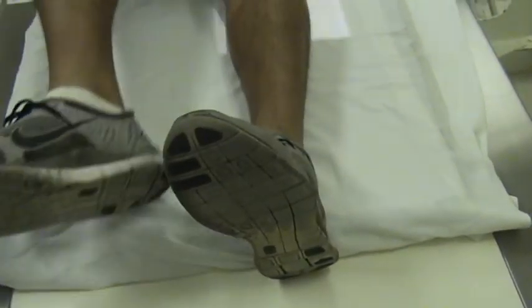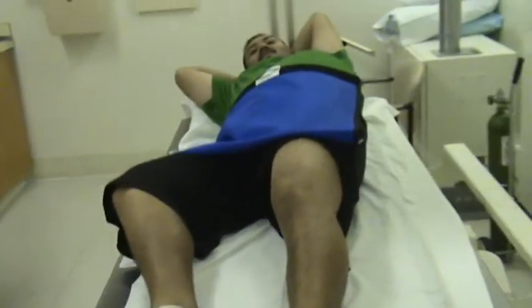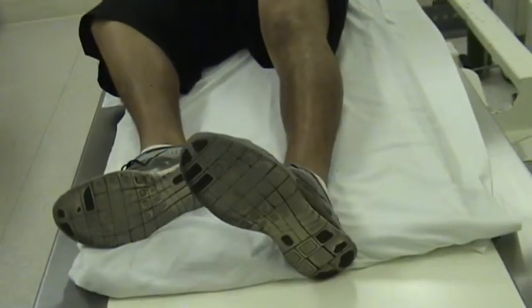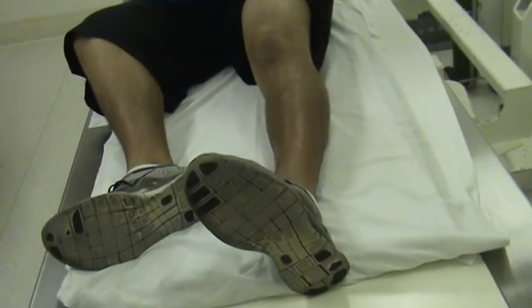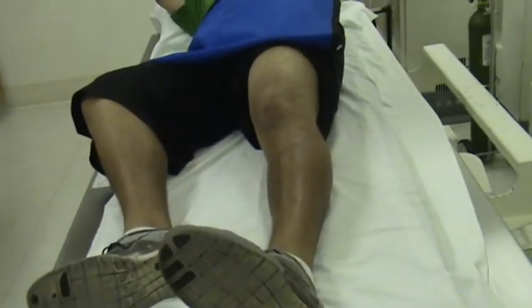For our next shot, we will have the patient rotate slightly, internally rotate his knee 45 degrees. We will maintain our 5-degree cephalic angulation of our tube throughout the shots of the knee.